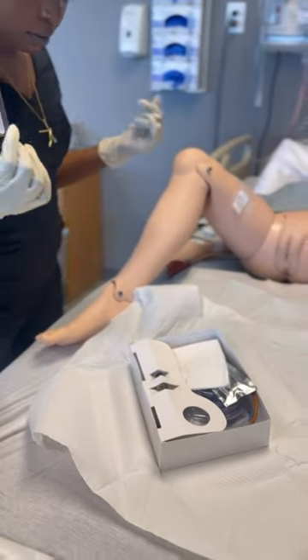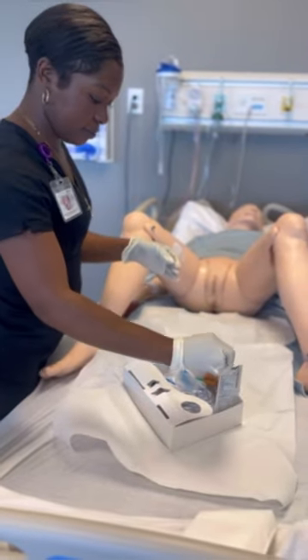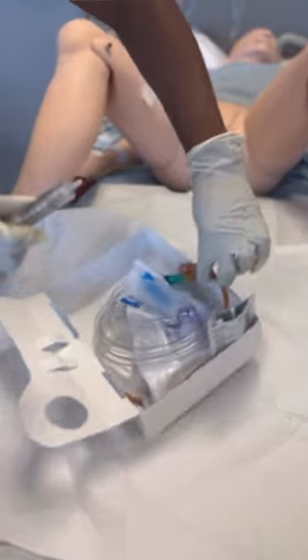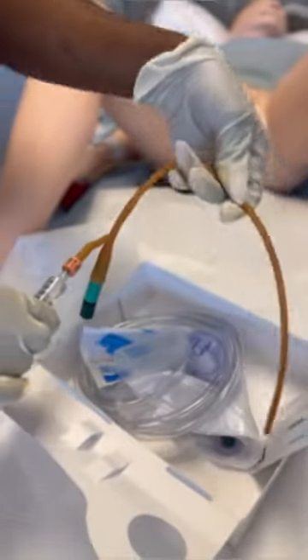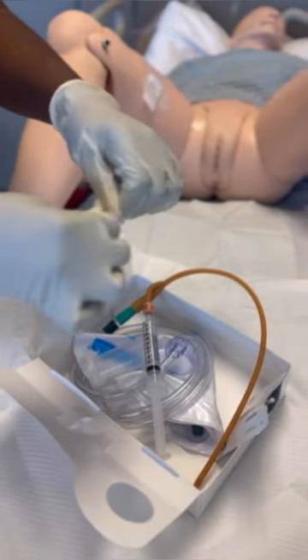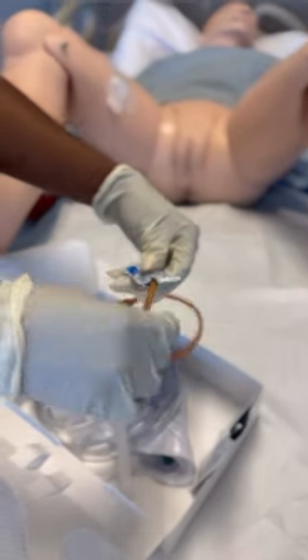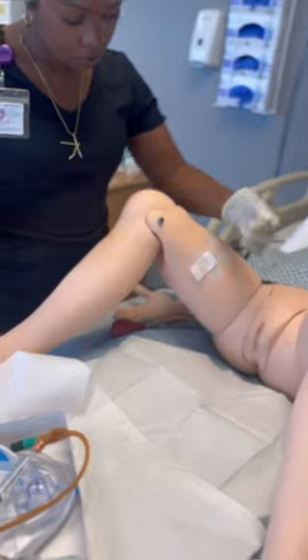At this point you are now sterile, so you can touch anything inside the kit. In the kit there is another drape if necessary. We also have our iodine swab sticks — go ahead and prepare those. You also have a syringe used to inflate the balloon that secures the catheter inside the patient, so set that up. It will indicate how many mLs are needed to completely fill the balloon — for example, a 10 mL syringe connected to your catheter. Finally, set up your lubrication: open it, create a hole big enough to place your catheter in, insert the catheter into the lubricating jelly, and set it aside. The three things to set up before touching your patient are: syringe into the inflation balloon, lubricated catheter, and swab sticks open and ready.